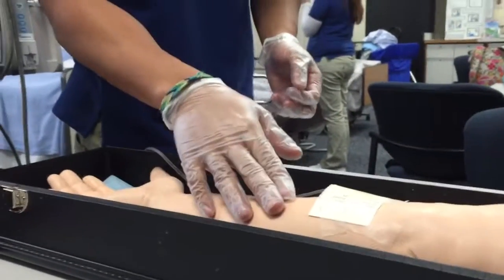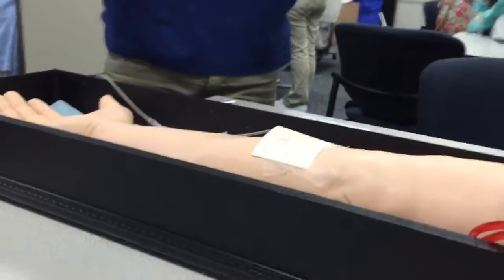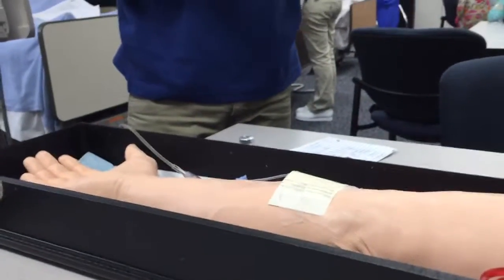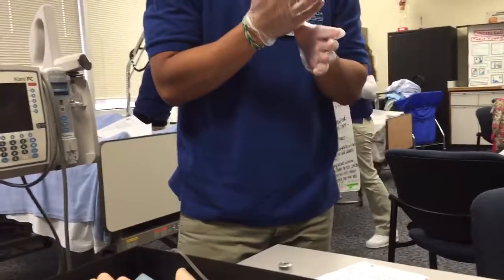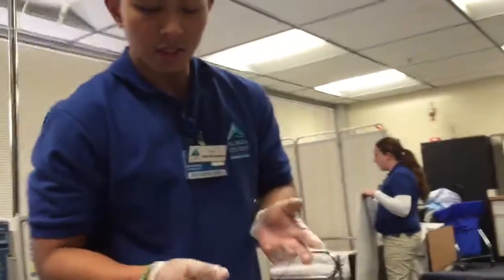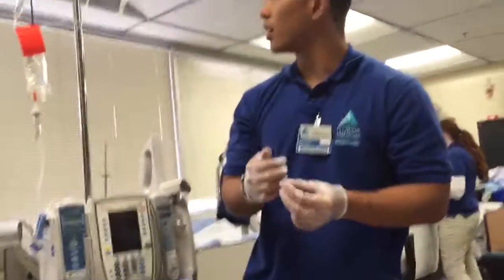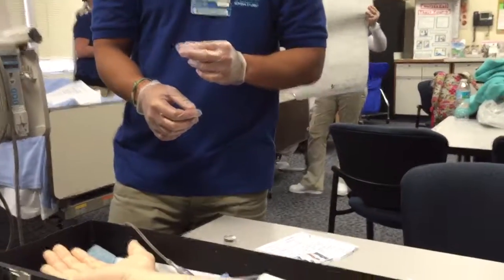Now I'm going to go ahead and document my findings. I'm just going to go ahead and document the dose, the route, the type of medication, the intake and output, and the amount of time, the date, the route, the medication, and the amount administered. And then I'm going to document the condition of the site, which looks good, it's still patent. The normal saline seems to still be running fine. What else? All the clamps are open, and I think that'd be it.